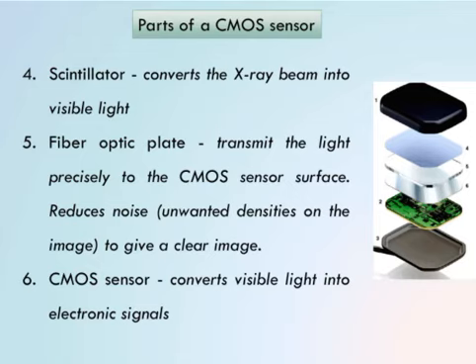Okay, so in the radiography also, when you see any unwanted areas that can compromise the quality of the image, we call them noise. Okay, so it's called a radiographic noise. Like, for example, when you do the processing of the X-ray film, if you accidentally put the finger on the surface of the film, then you get the fingerprint on the film when you develop the radiograph.